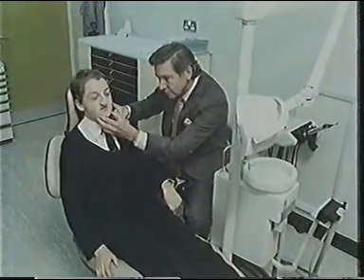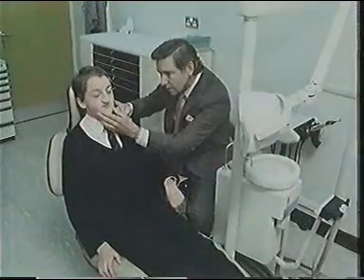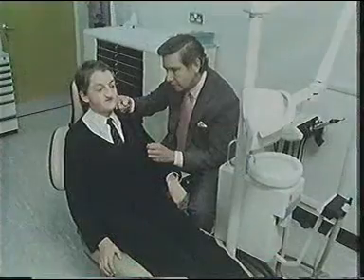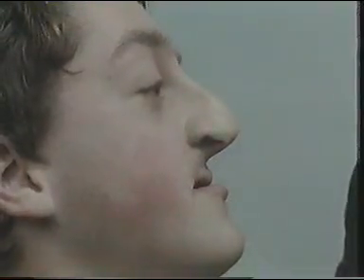Computers have been used in medicine for a long time. But here in University College Hospital, they're developing a new and unusual application. This patient has a badly formed jaw, which is going to be corrected by surgery. Which part of your face do you think is wrong? Upper jaw, I think. Okay.